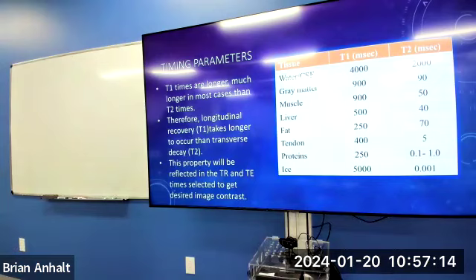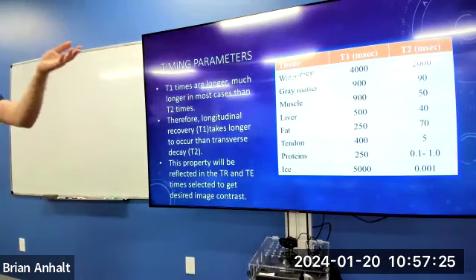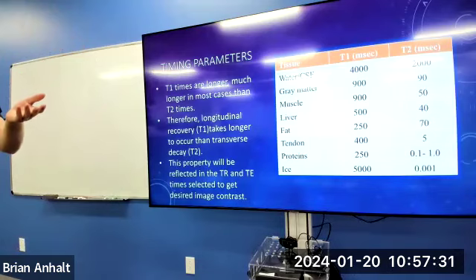No, this is a common question. So you're thinking about this stuff, which is good. We don't want everything to have the most signal. If everything had a bunch of signal, we wouldn't have any contrast, right? We want some tissues to have a lot of signal and others to not. We want to have a range, we want to have contrast, so that we can see the differences.